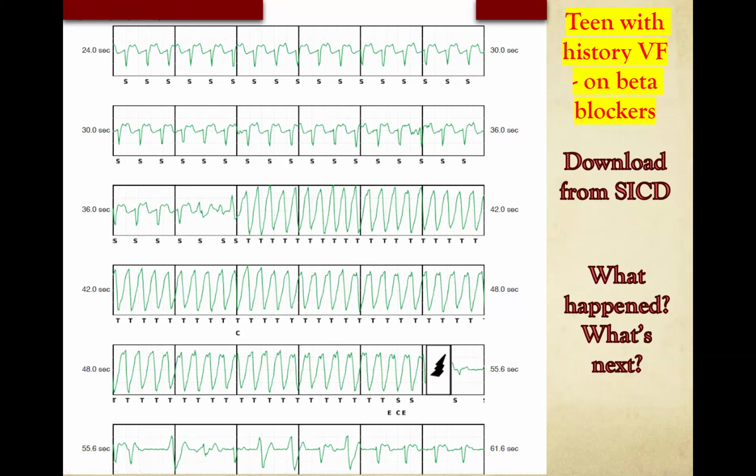Some of the companies use a smartphone app, and others have an actual device roughly the size of two or three cell phones stacked on top of one another that plugs into the outlet at home. It is essentially a cell tower itself, and through Bluetooth it will communicate with the device.